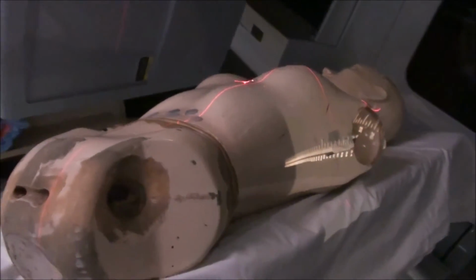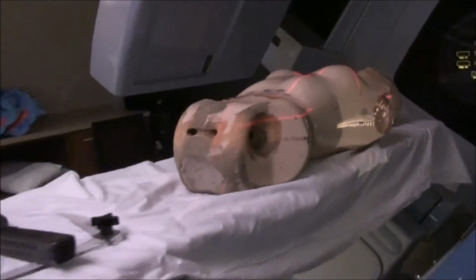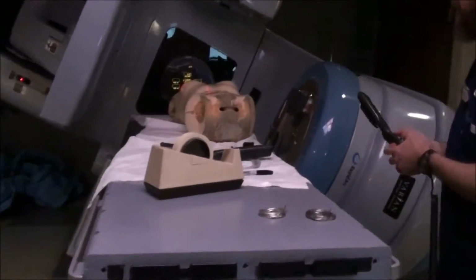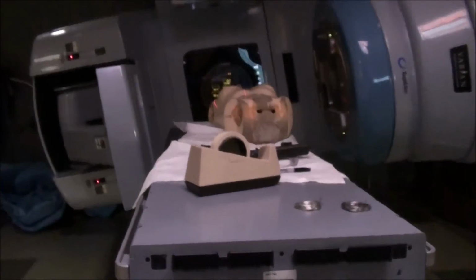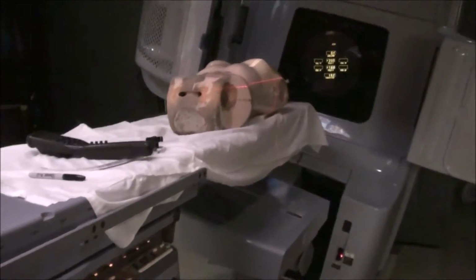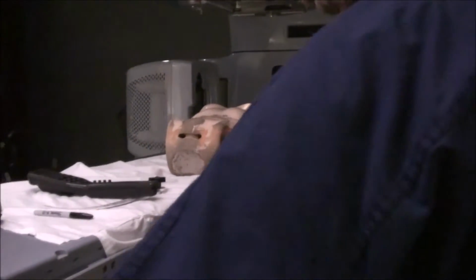Once you've taken your other x-ray, you've got them both approved. The next thing you need to do is get your separations. What we're going to do then, I'm actually going to rotate back up, patient back over again. We've taken our x-ray, we've got all the marks in the patient. Now we have to get separations. Don't tear her arm off, don't tear the equipment up. You can leave the gantry up here. You've already got your SSDs, we're all good.